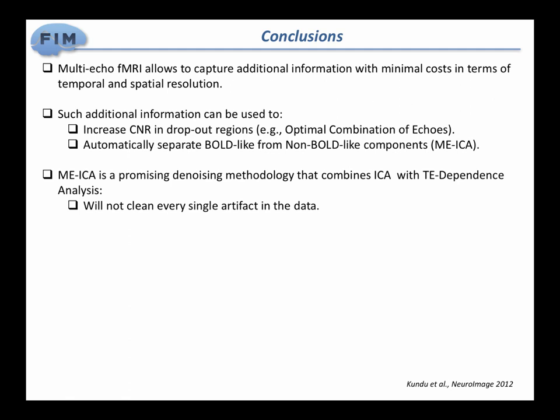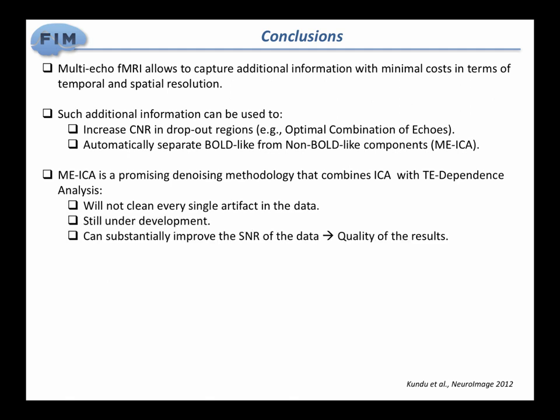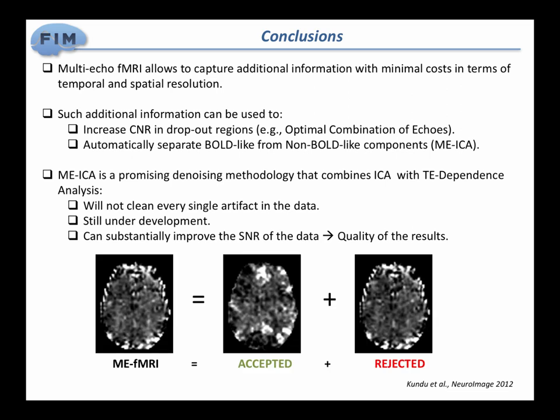It will not clean every artifact. Just because you run MEICA on your data, you can't say this is artifact free, that whatever I get is the ground truth. No, it's just another way of hopefully removing more of the artifacts in your data and extracting more meaningful information out of it. It's still under development. It can definitely improve the quality of your data.